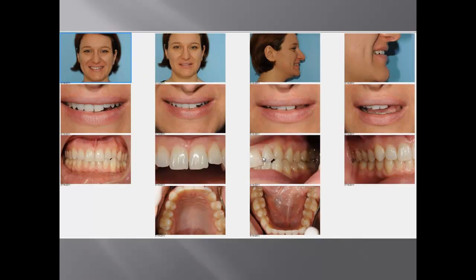This patient came to my office with a chief complaint that she doesn't like her bite, and she has a crossbite on her left side, and her midline shifted to the patient's left. She doesn't have any concerns or symptoms at this point, except the position of her teeth. She doesn't have TMJ problems, or problems with her bite and everything else. So after the clinical examination, this gave me the idea that it's going to be a simple case. We have to reposition her teeth.